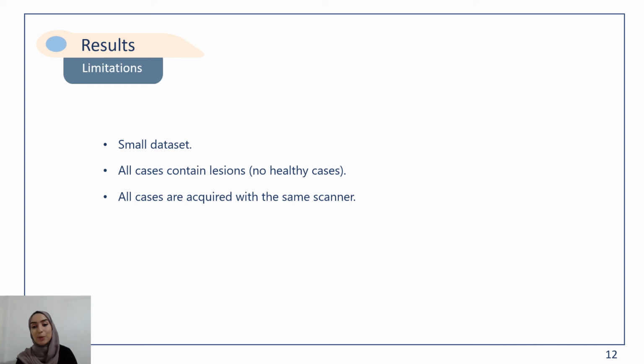Now, the limitations of our study were that we used a small dataset and all cases had lesions, so there were no healthy cases, and also they were all acquired with the same scanner.